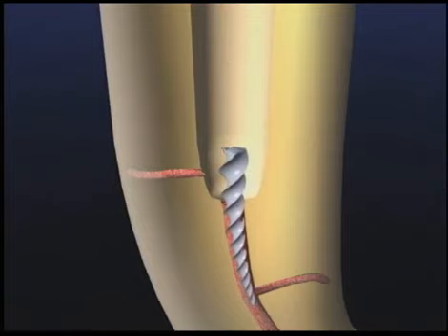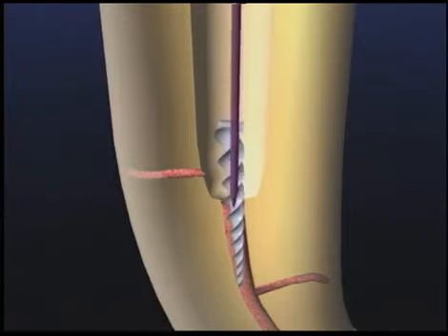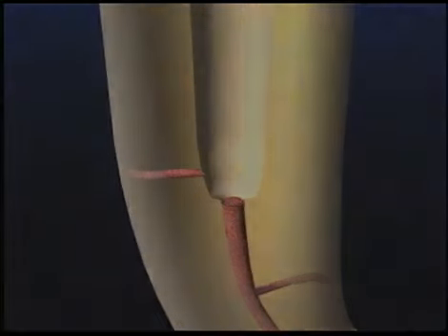As we progress deeper into the canal, a longer length and smaller diameter titanium instrument may be necessary to work safely. In my experience, if we can free up about 1/3 of the separated instrument's overall length, it will begin to loosen, unwind, and usually jump out of the canal.